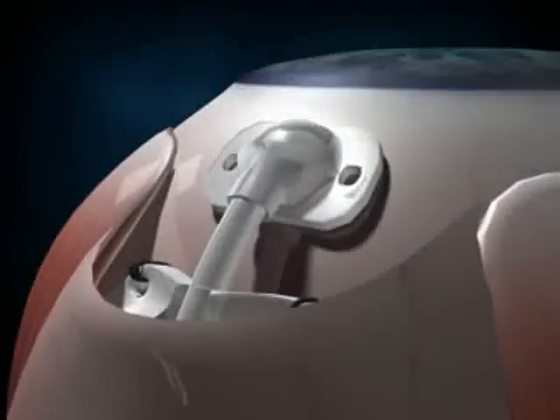Suturing the clip. Place the clip over the tube and suture it through the 2 suture holes on the sides using 8/0, 9/0, or 10/0 nylon or Vicryl sutures.